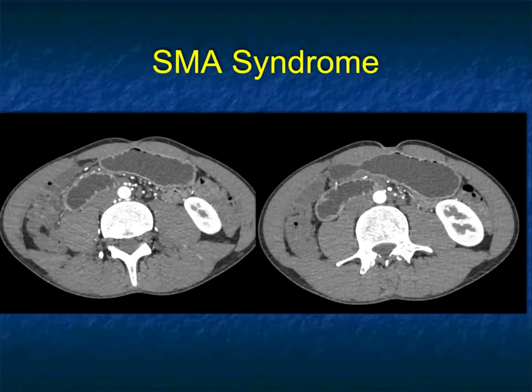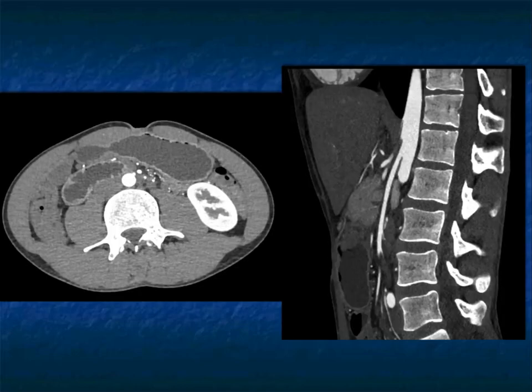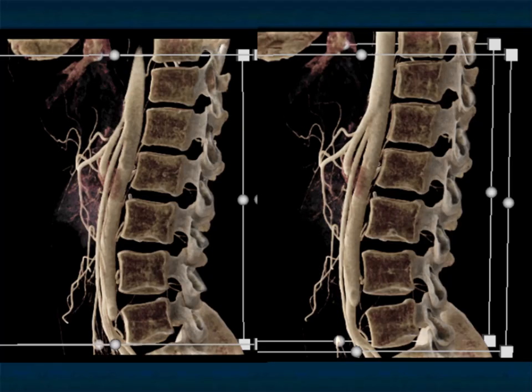Another example — again, the stomach is distended, but there is the duodenum. There's the transition point approaching the SMA, and there it is again — the narrowing, the SMA, the obstruction. A classic case of SMA obstruction. And here it is with cinematic rendering. Cinematic rendering is a nice view, doesn't change the diagnosis, but look at the narrowing of the SMA angle, beautifully shown in that example.